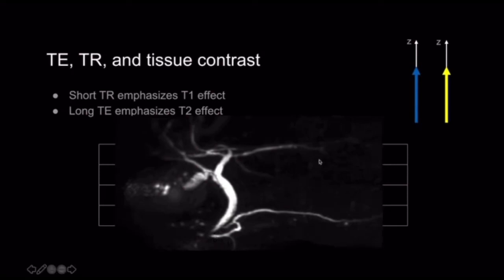This is an example of a thick slab MRCP image, and we'll talk about how we acquire these in a little bit. But essentially, these are just very, very heavily T2 weighted images. Remember, water is very bright on T2 weighted images because water has a long T2 relaxation time. So if we emphasize T2 effects to a very, very high degree, we're going to get something like this, where signal is lost everywhere else, and only the water, or things like water, are maintaining their signal.